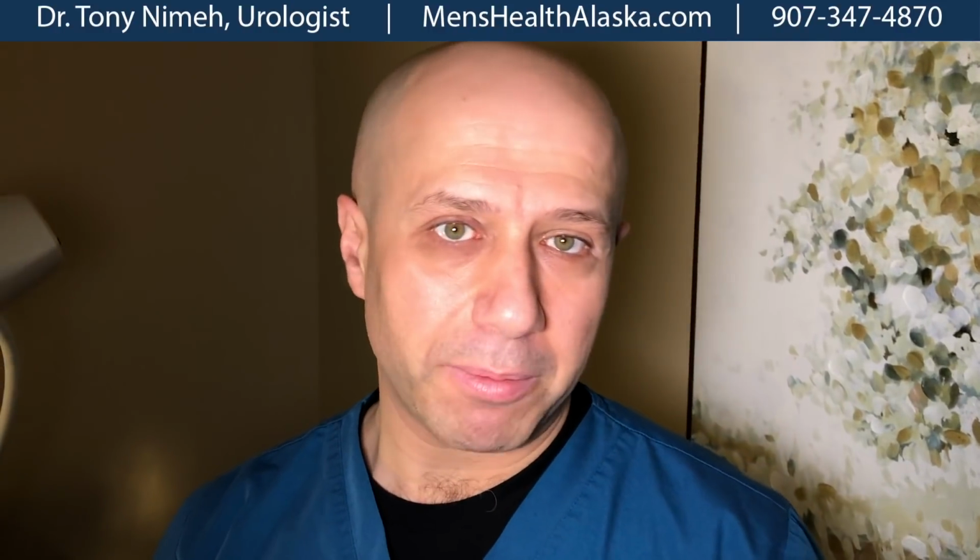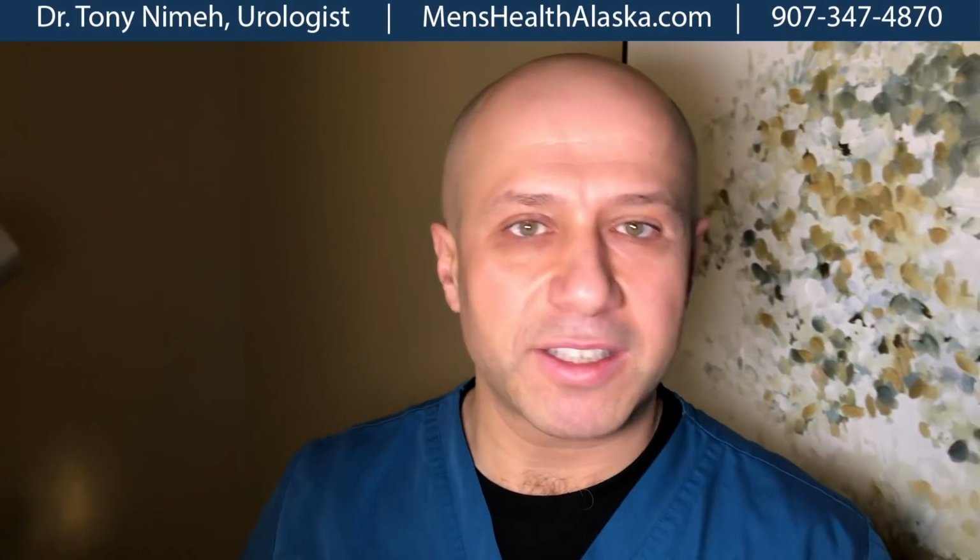I'm a urologist, and I see a lot of patients with prostate enlargement, and I want to give you an idea of what happens with prostate enlargement, why it gives you urinary symptoms, and what we can do to help alleviate those symptoms. The big mystery is, why does the prostate affect the urinary stream if the prostate is not part of the urinary system? And I will show you on a model where the prostate is, how it's actually causing the urinary symptoms, and how we can help fix that problem by opening up the prostate.